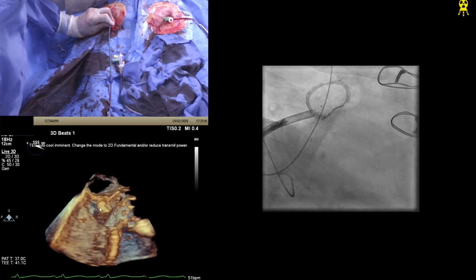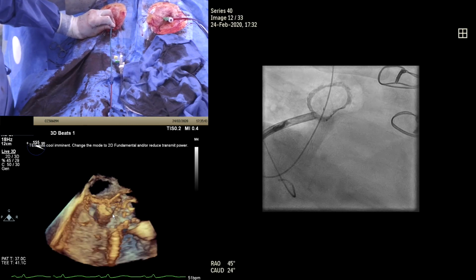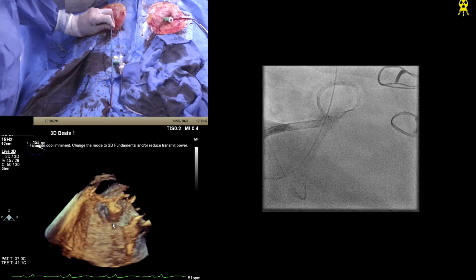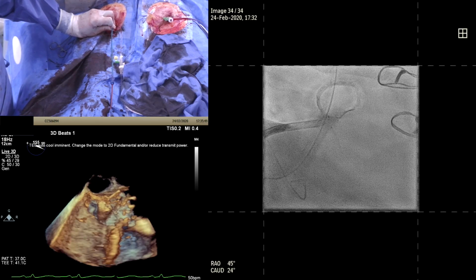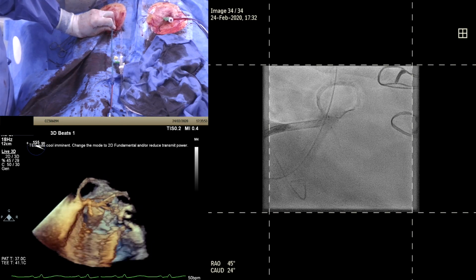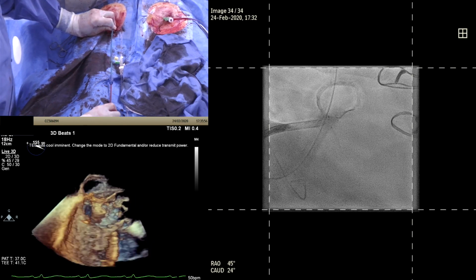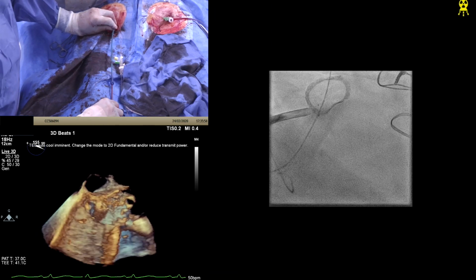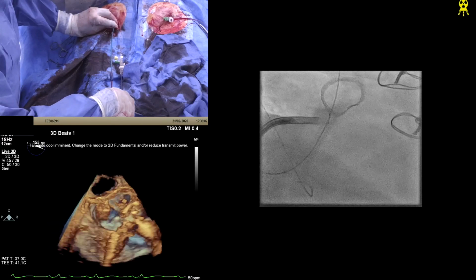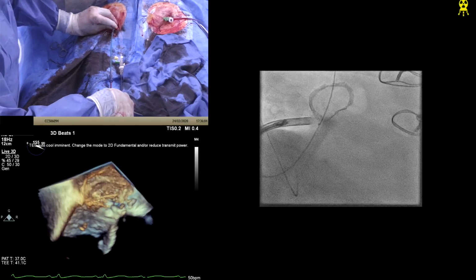I can see the angle it's coming in, slightly tilted. I think only one disc is out, even though it looks like two on your echo. I think it's only one disc you've got out there. Yeah, okay. It's just the dropout from the sheath above it causing that. If I rotate the sheath... yeah, that's better. So you've rotated it.